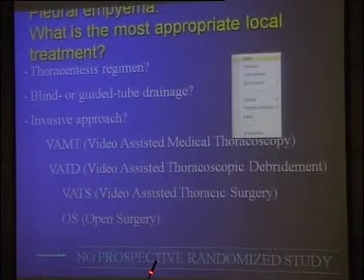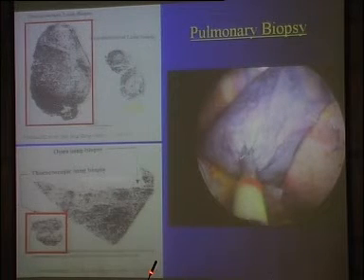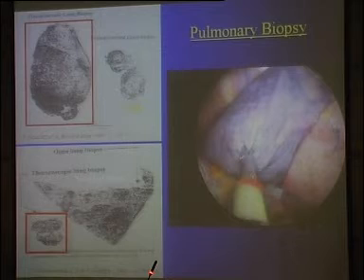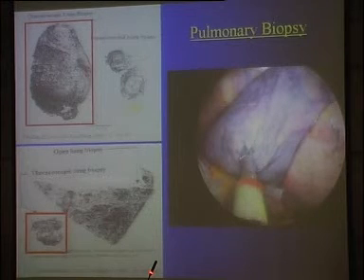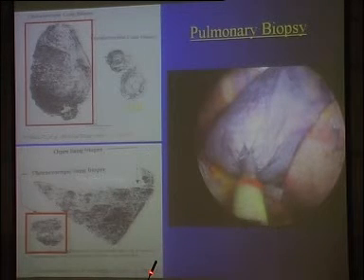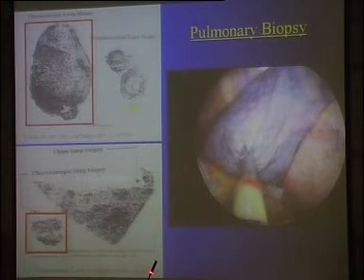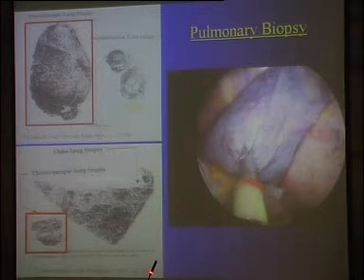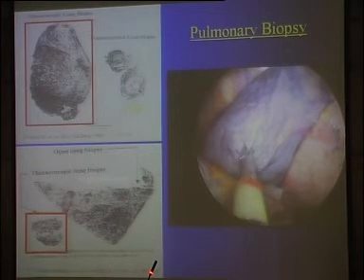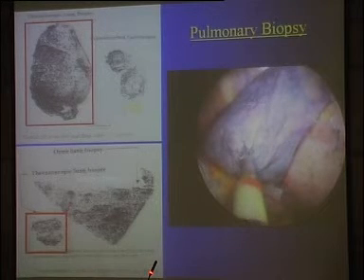However, experimental studies and clinical trials show, and I would like to give you a simple message, that there is no significant difference between a lung biopsy by thoracoscopy route, using coagulating forceps, in comparison to samples from surgical management using an automatic stapler, okay? But if you need a vessel in your specimen, forget thoracoscopy lung biopsy because it's not deep enough. You understand? Otherwise, for the superficial part of the lung, I mean interstitial lung disease, carcinomatous situations, infectious situations, etc., it's very relevant.